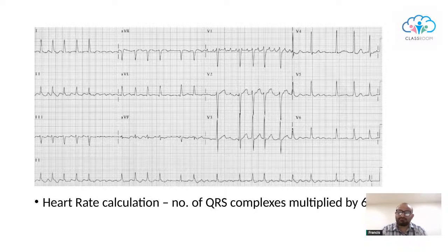Atrial fibrillation, early studies have found that prolonged Holter monitoring even after hospital discharge increased the AF pickup rates. And some studies found that up to 12% of patients who had CVAs had undetected atrial fibrillation that was revealed only on prolonged Holter monitoring.